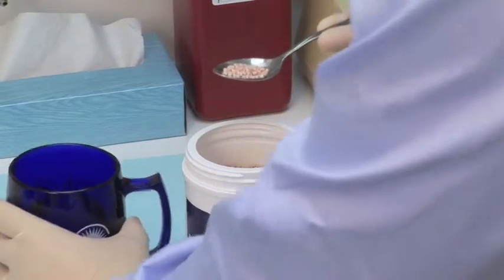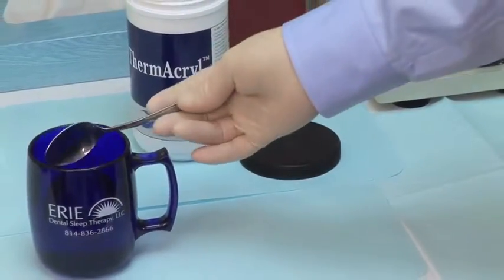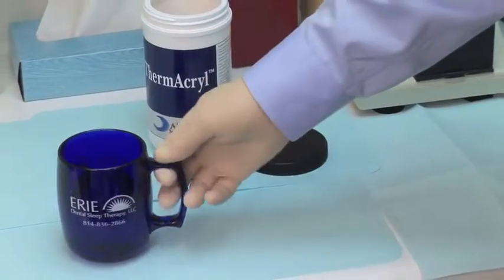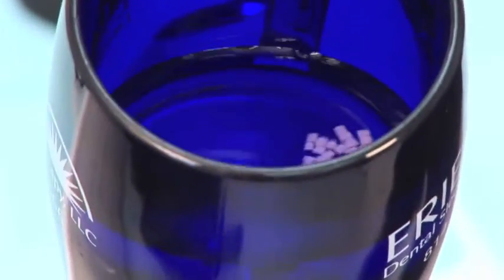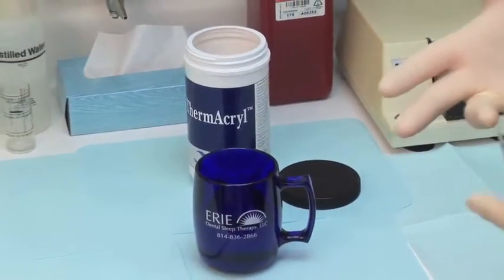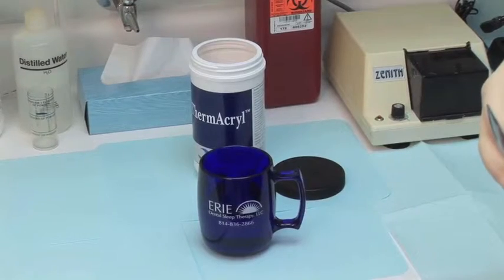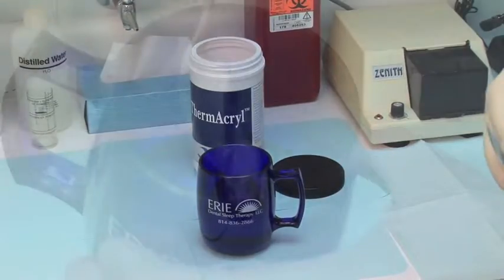We have filled a cup half full with water. We're going to place the material in there — you can see it's still in its pellet form — and we're going to place this in a microwave for two minutes. Placing the material in the microwave will turn it into a plasticized material that we will use for our Centric Occlusion Repositioner.